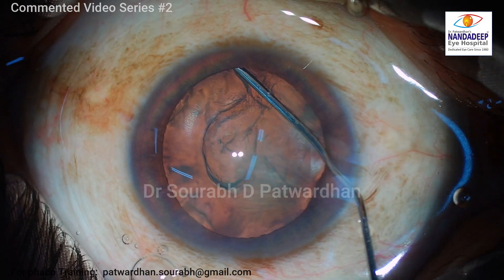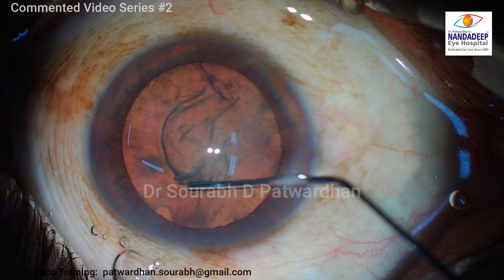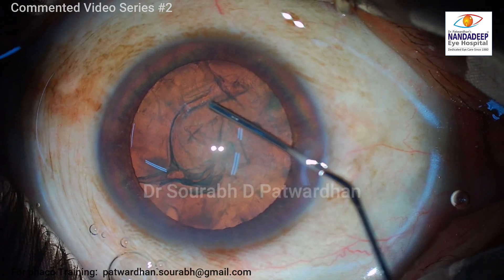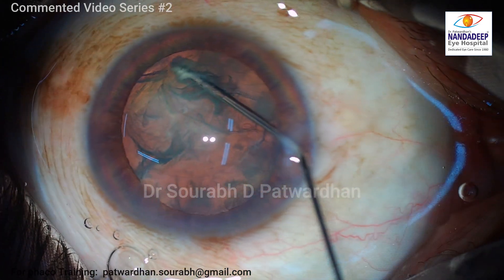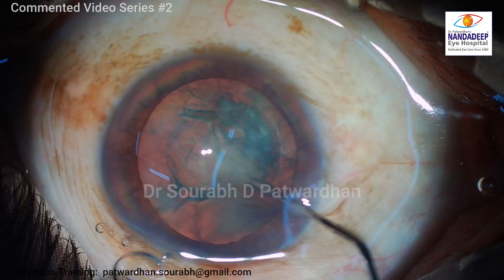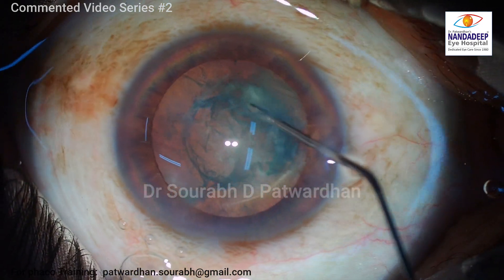Though it is not seen here on the microscope with the stereoscopic view, I can feel that the lens is quite thin — that's an unusual feeling we have when operating. It's not a very hard cataract; it's a softer one, more of cortical nature, but it's not very soft either where I can just aspirate it out.